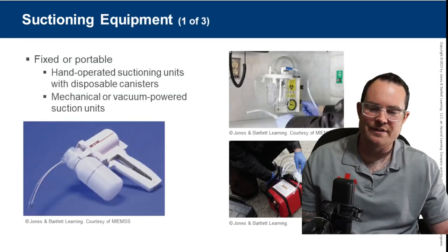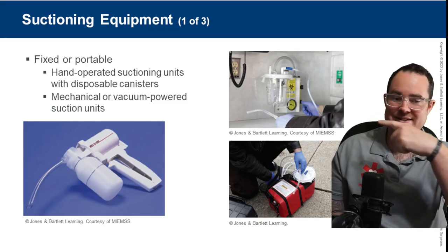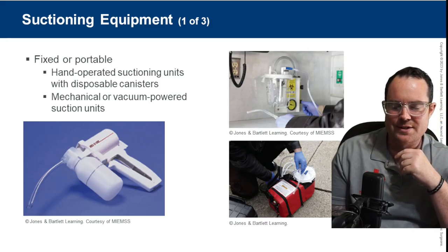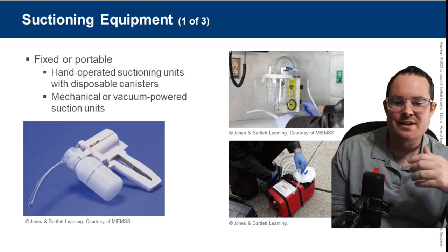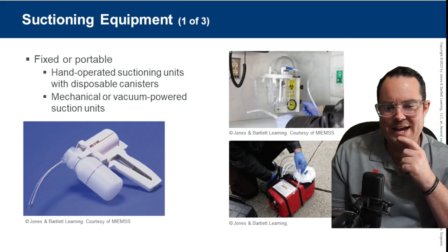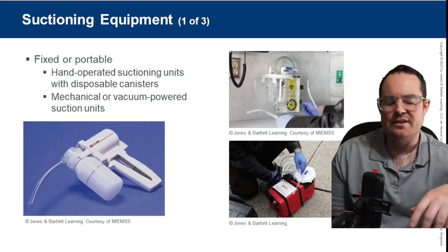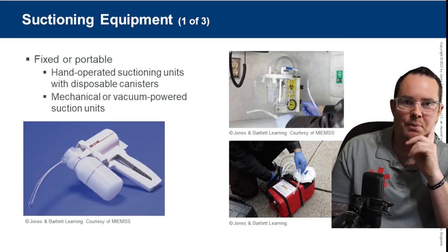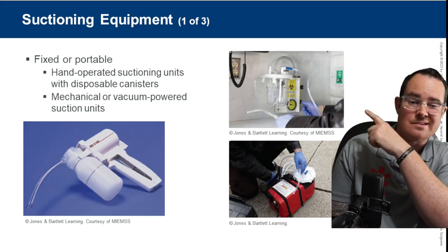There are several different types of devices that we can use for suctioning. All the way on that side, we have a portable manual suction unit — usually called suction vax or emergency vax. The one next to me is a battery-powered suction unit, typically used when we go into someone's home. The one up top is on board, wired in, no batteries required.